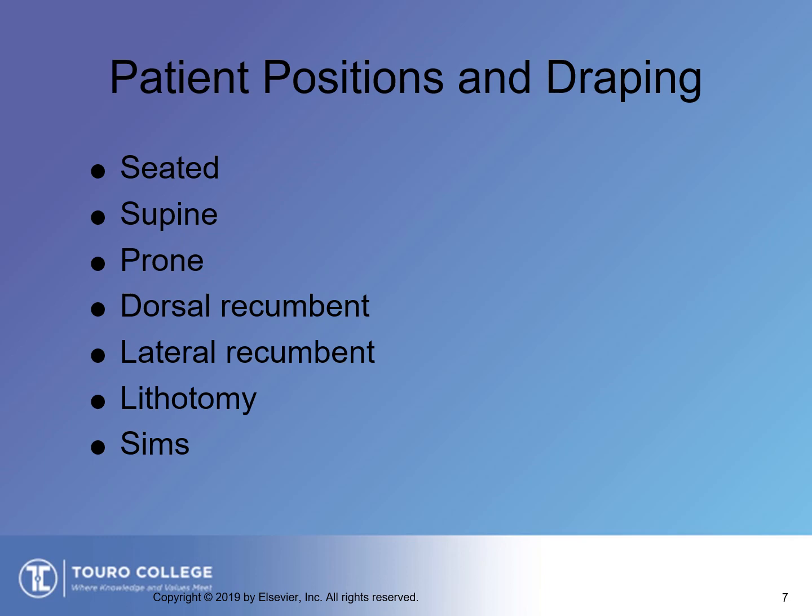The patient can be placed in lots of different positions. I want to do what makes the patient most comfortable while providing me the ability to perform the examination that I need to perform. I've never done, well, I guess maybe I have done a prone, checking out a hip.